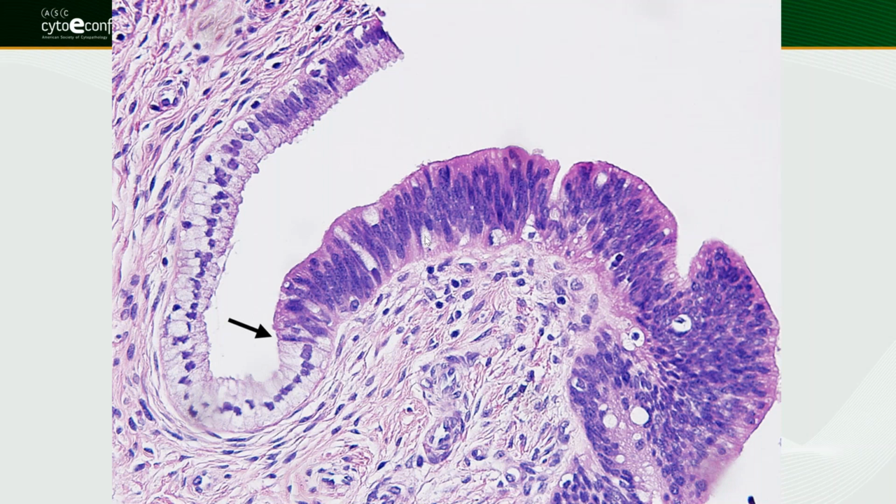This is exactly the criteria we will use in cytology to diagnose AIS: elongation and enlargement of the nucleus, hyperchromasia of the nuclear chromatin, and irregular nuclear membrane. You'll notice that nucleoli are actually inconspicuous. Prominent nucleoli is not actually a feature of AIS. So again, the cytologic criteria are based on these histologic features.